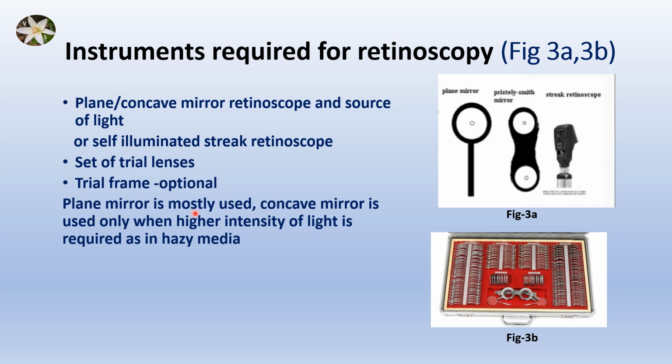Plane mirror is mostly used. Concave mirror is used only when higher intensity of light is required, as in hazy media.